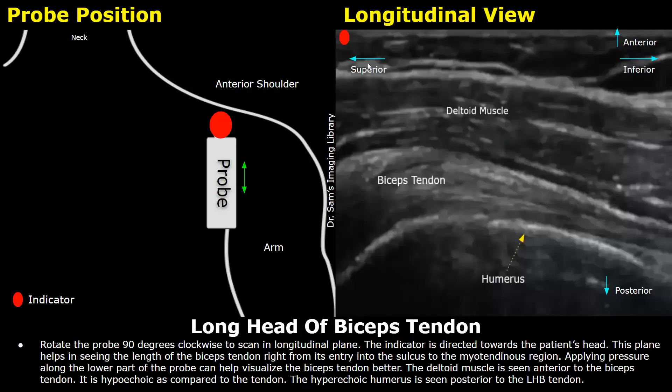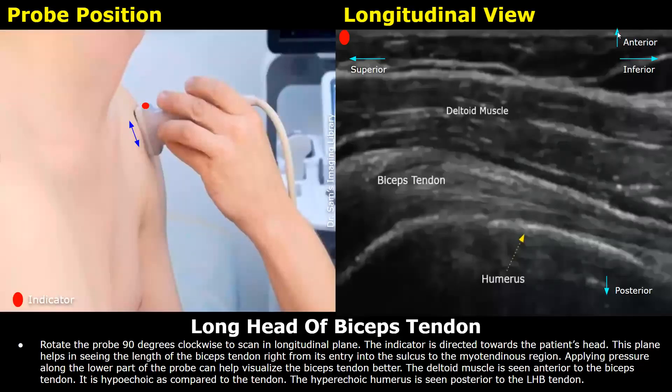In the longitudinal view, the left side of the image is towards the patient's head — the superior part — and the right side of the image is towards the patient's feet — the inferior aspect. The anterior and posterior areas are the same as in the transverse plane. In this image you can see the probe position more clearly: it is placed in a longitudinal orientation over the anterior shoulder with the indicator towards the patient's head. First locate the bicipital groove and biceps tendon in the transverse plane, then rotate the probe 90 degrees clockwise to scan in the longitudinal plane.